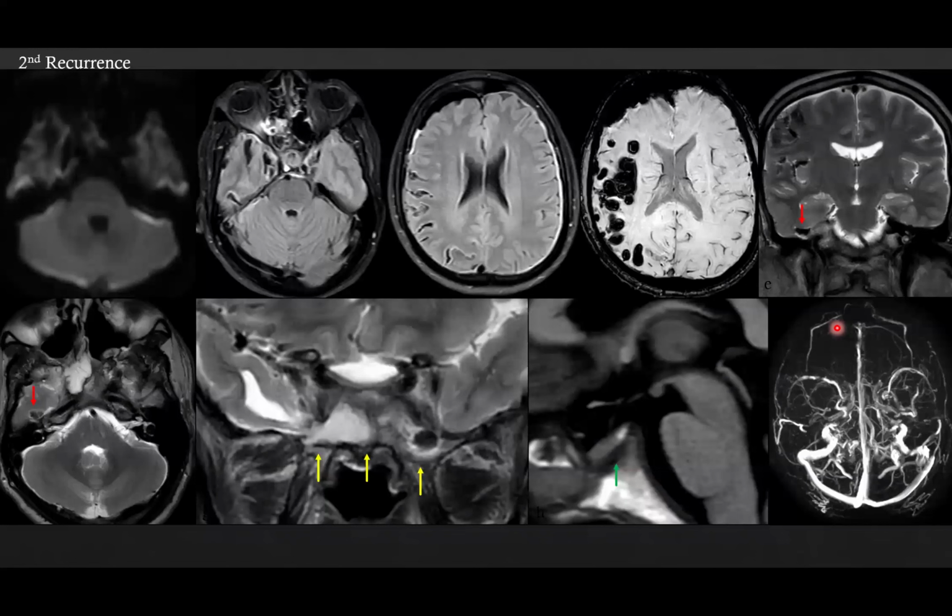He came back again after a few months with similar symptoms of altered sensorium, and this time he said he had a hissing sound in his right ear. Again, imaging now shows pneumocephalus. Interestingly, the pneumocephalus is seen only in the right hemisphere. It is along the subarachnoid space. There's no extension into the ventricle. Also, there is subdural effusion seen on both sides.